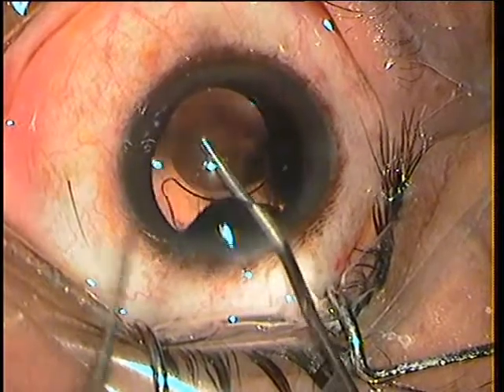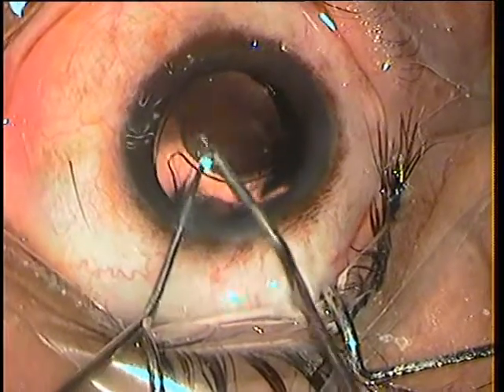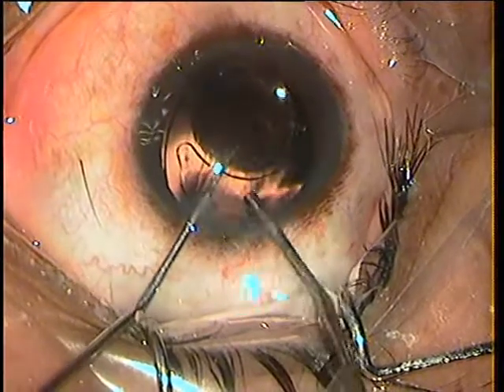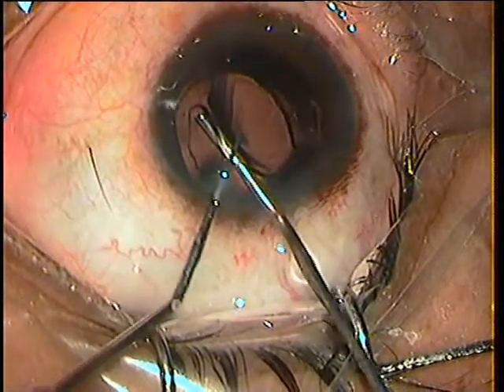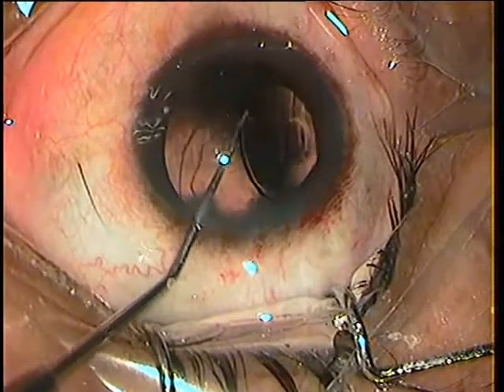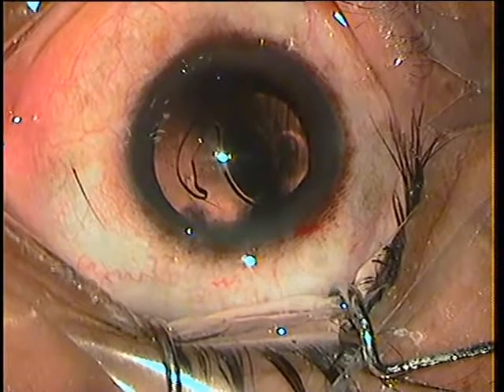The first thing I did was put some viscoelastic below the lens and try to take it out of the bag, especially to free the intact haptic. I am using two instruments — a spatula and a Kuglen's hook — trying to coax the lens out of the bag. I have managed to get the haptic out.